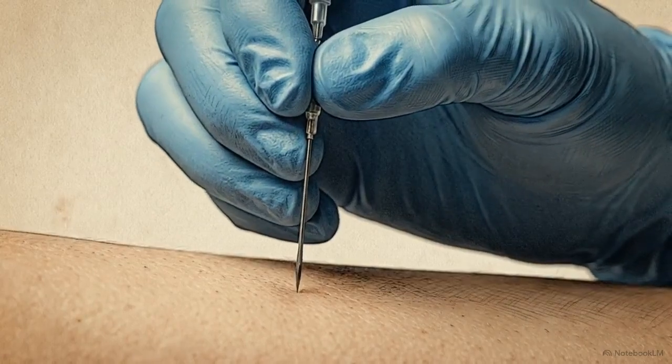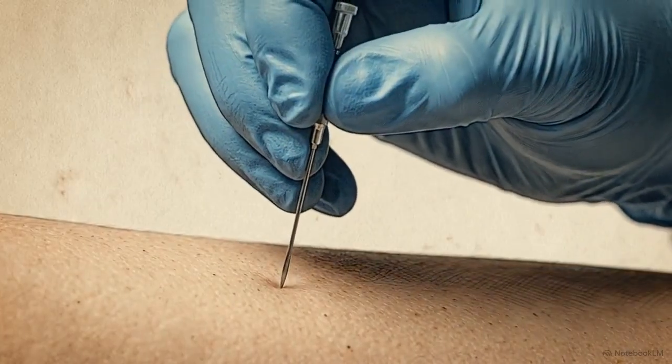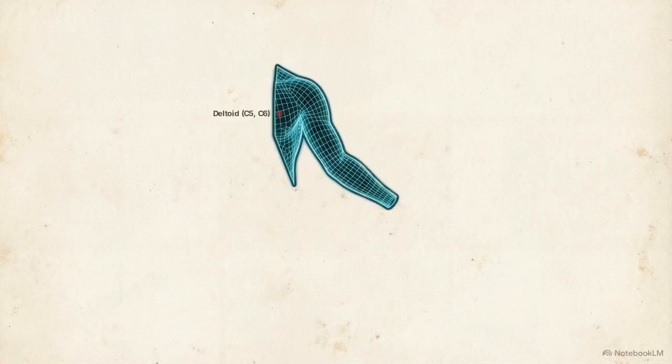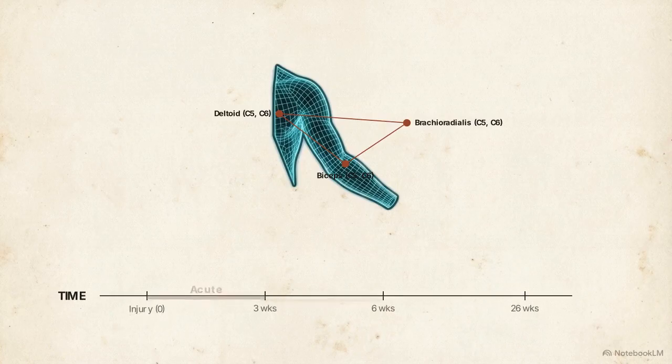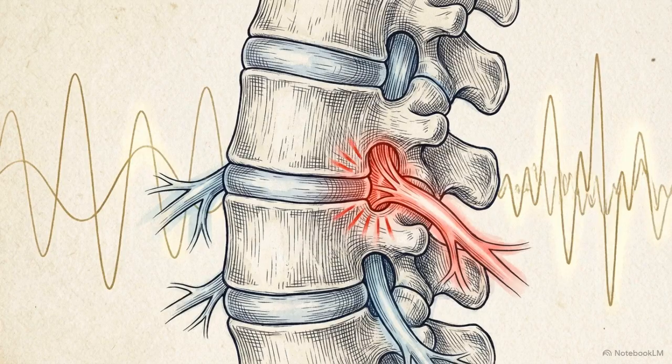To actually confirm a radiculopathy, the diagnostician must shift tactics and rely entirely on the needle electrode examination, or NEE. Successfully executing the NEE requires the examiner to map a precise spatial triangulation of affected myotomes and then evaluate those findings against a rigid biological timeline of nerve degeneration. Electrodiagnosis generates a functional snapshot, requiring the examiner to actively engineer the study to navigate the anatomical blind spots inherent to the spinal cord. The high rate of negative studies is a direct consequence of the physical location of the nerve compression relative to the cell bodies.